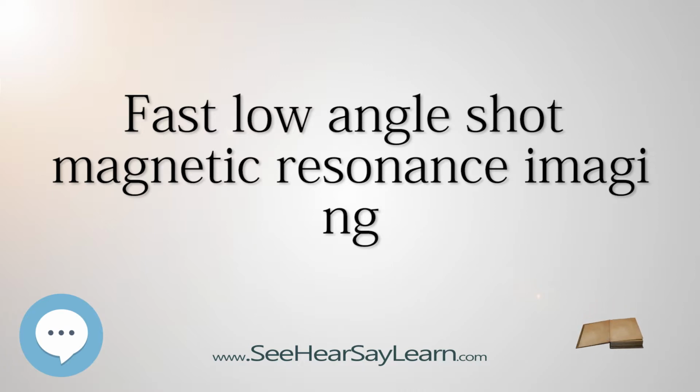FLASH reduced the typical sequence interval to what is minimally required for imaging: a slice-selective radio frequency pulse and gradient, a phase encoding gradient, and a reversed frequency encoding gradient generating the echo for data acquisition. For radial data sampling, the phase and frequency encoding gradients are replaced by two simultaneously applied frequency encoding gradients that rotate the Fourier lines in data space.